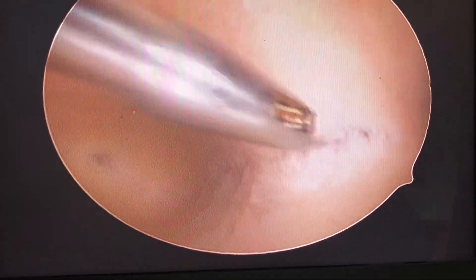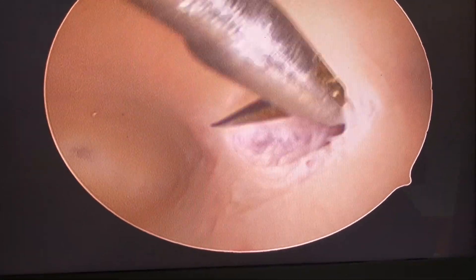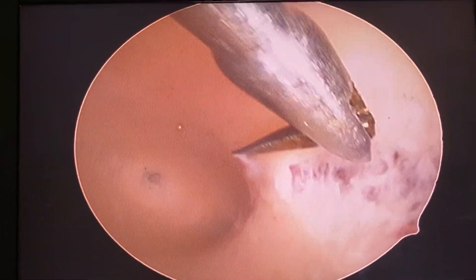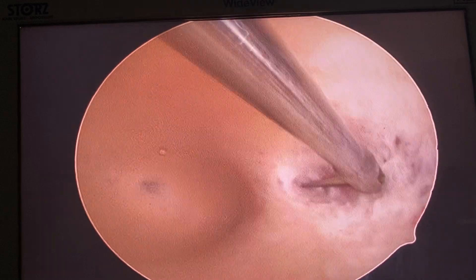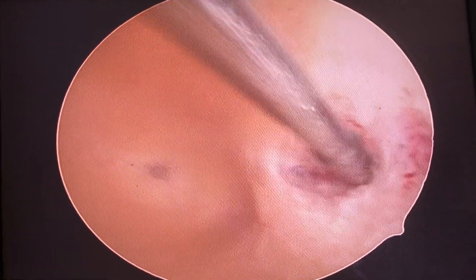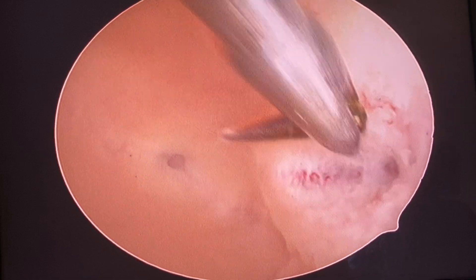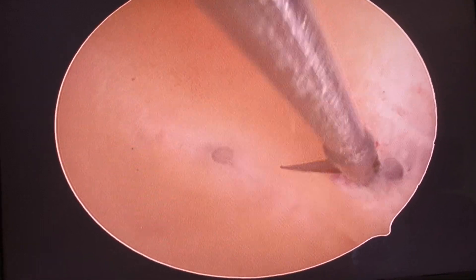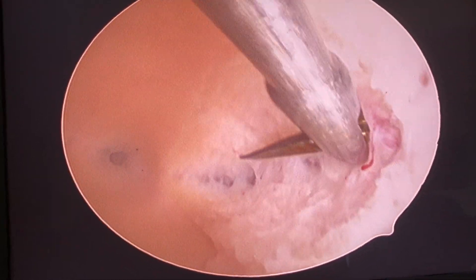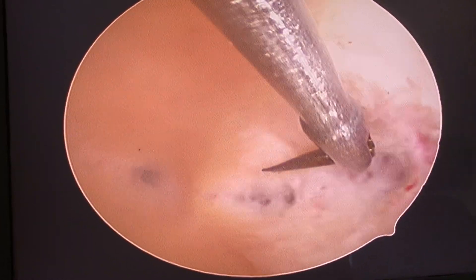Cut. You have to cut at the same level here. When you come close with the lens, the light becomes very strong and creates reflection — I haven't finished this part. It's a very vascular septum, so be careful.